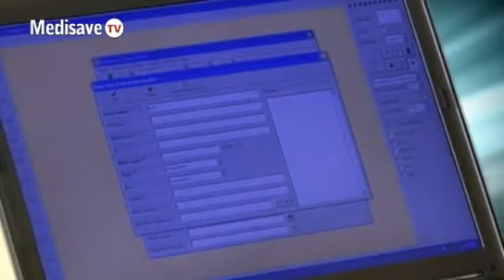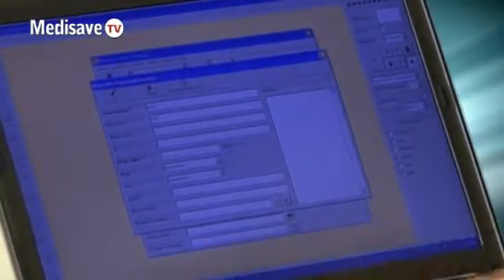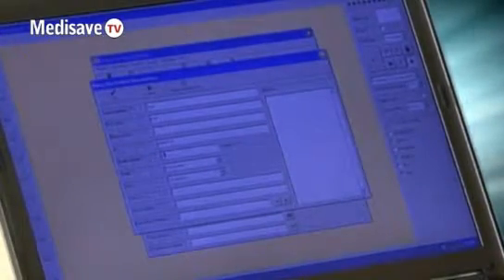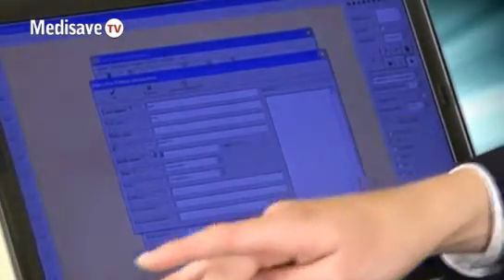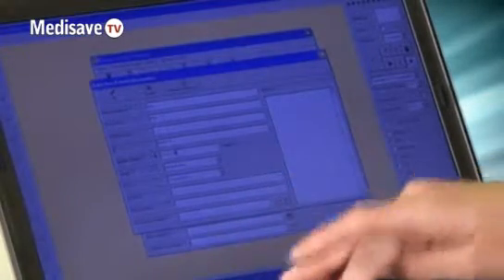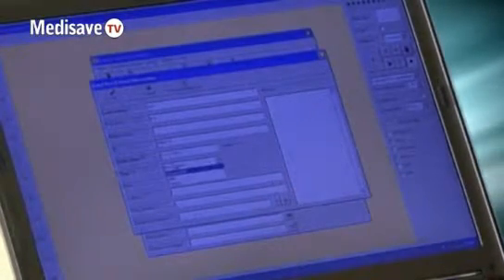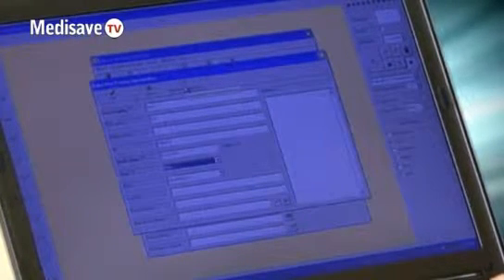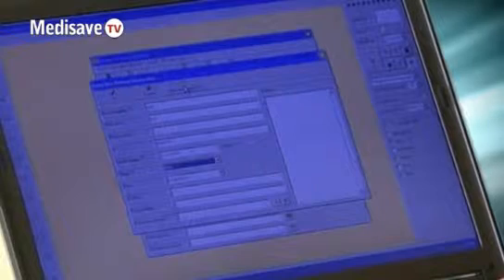Then to enter the patient's details, simply press on patient ECG and select new patient. Fill in the required fields: patient's name, their unit number, date of birth, and the patient's gender. Once you are happy with the information, confirm by selecting save and begin ECG.